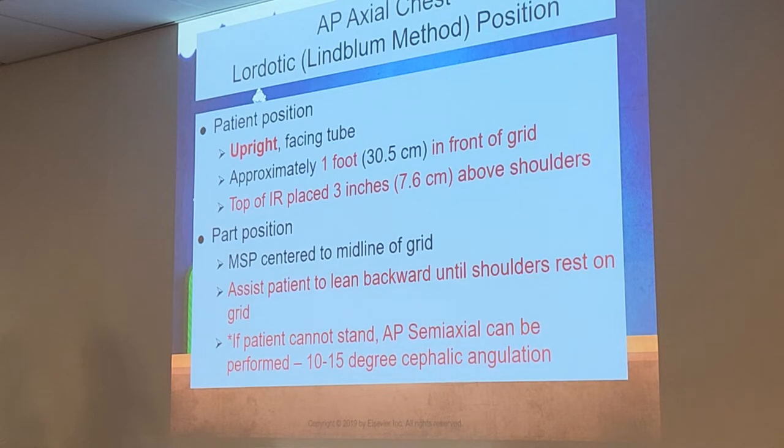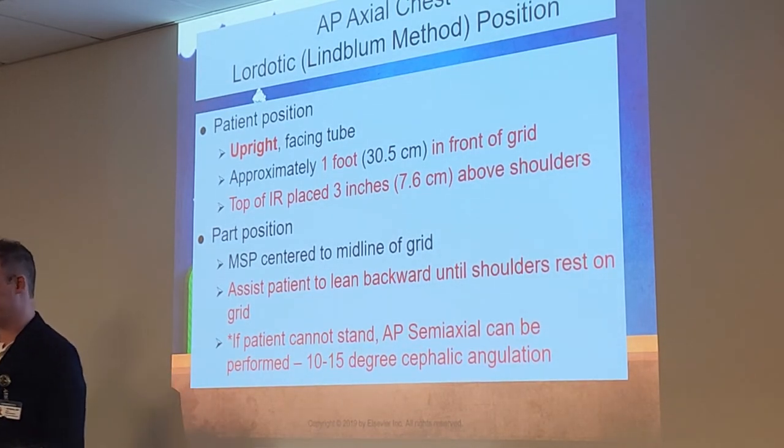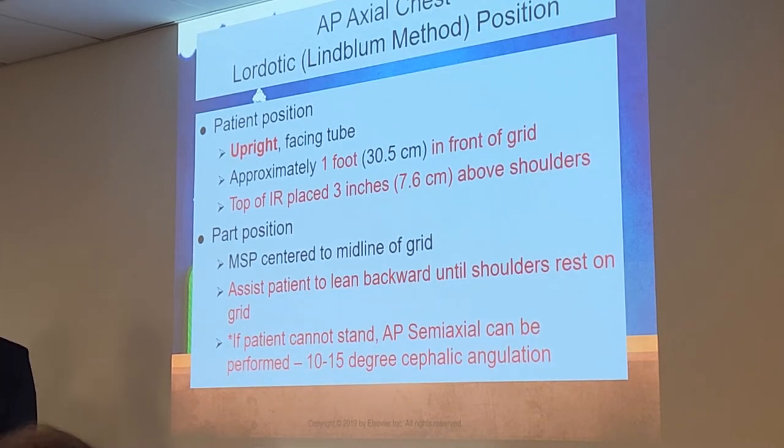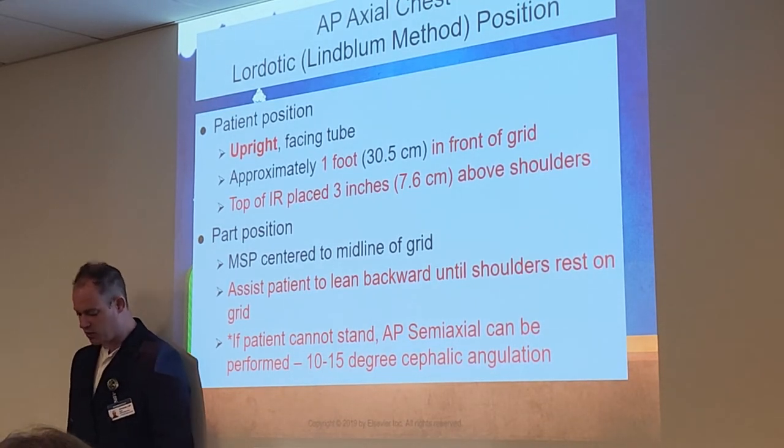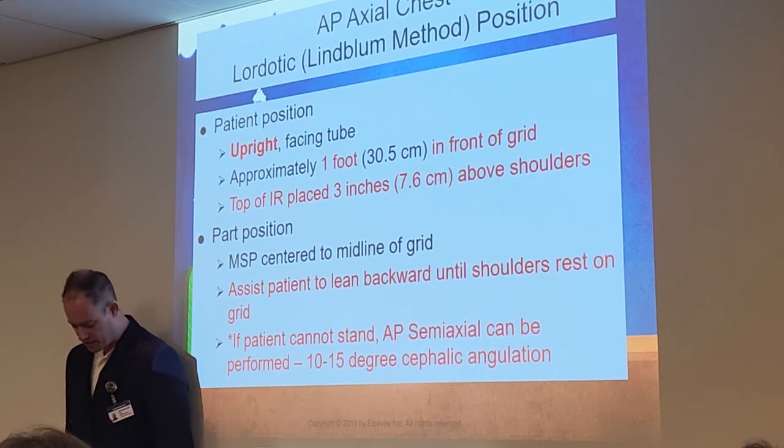Can you say a foot for the grid? Does that mean like... Yeah. 1 step. Just 1 step forward with both feet. Always have them just literally one step. Make sure you're not going too far forward, just 1 step in front of your foot.